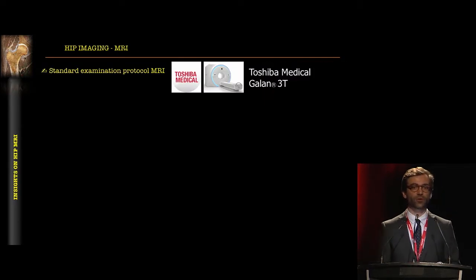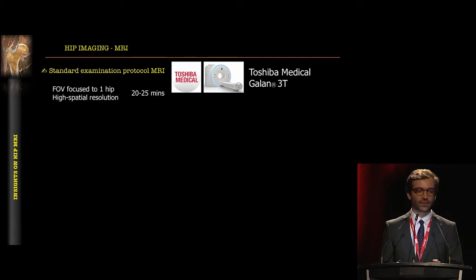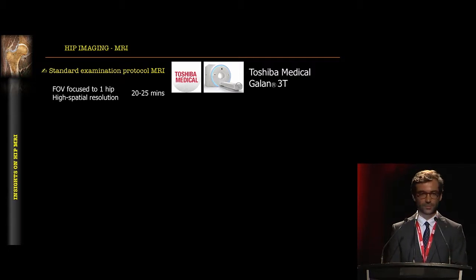Although it's a powerful technique, it should be performed in 3T or high field, high strength magnets, as we do now. We are happy to do it on our new Galan 3T. It's a protocol with a small field of view, focused on one hip, with high spatial resolution, in 20 to 25 minutes. It is one of our longest protocols.